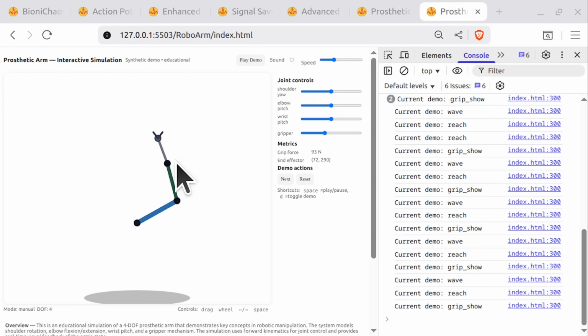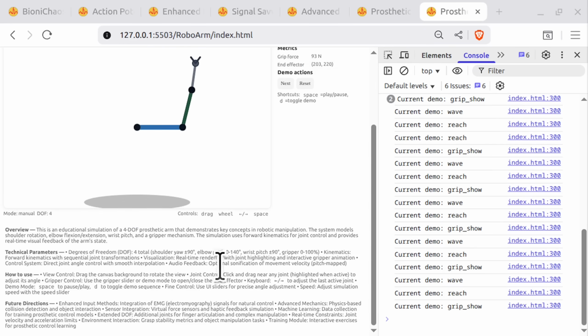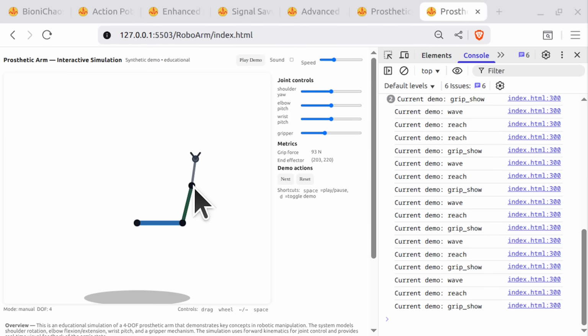Eventually, I'm not sure how difficult it will be to modify the code to do it, but we would like a demo mode where we could move a ball with the mouse, and the robot gripper would be trying to catch it, for example. So I don't know if you can just modify the code accordingly, or just add it as a description in the text for future directions.